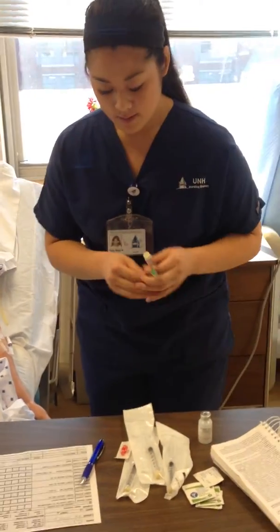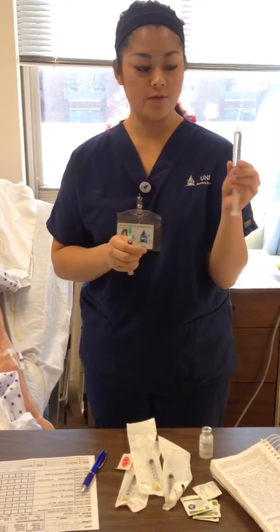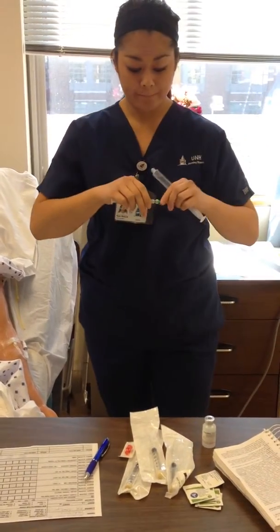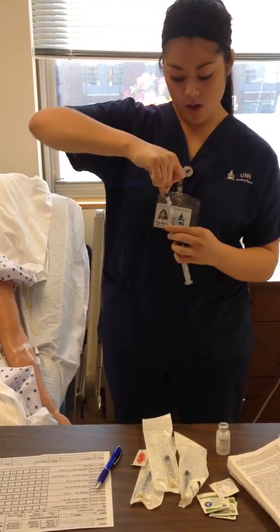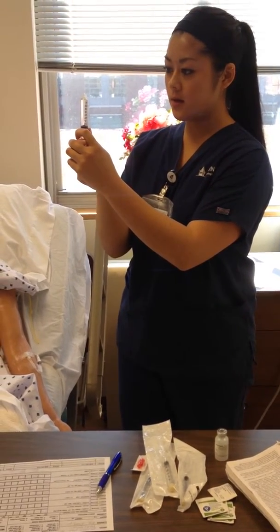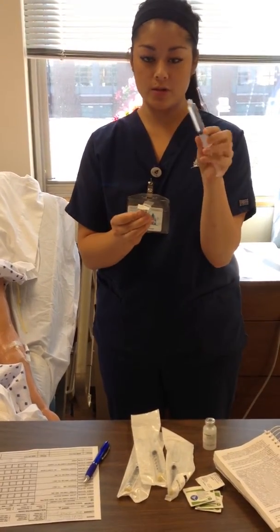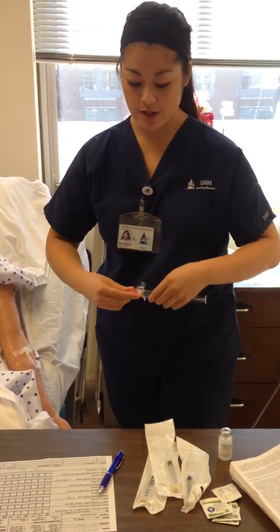And now we have the diluting. So this is a 10 milliliter flush. We're going to waste them into the trash can to make room for the dilaudid. If you had more than one med to give, or you were going to leave the room, you need to label this with the dose and drug. But we're right here with the patient, and we're only giving one drug, so I'm going to leave it here on the table.